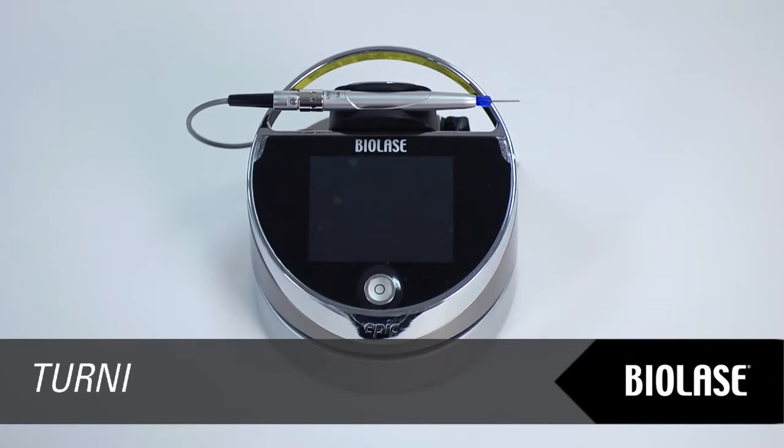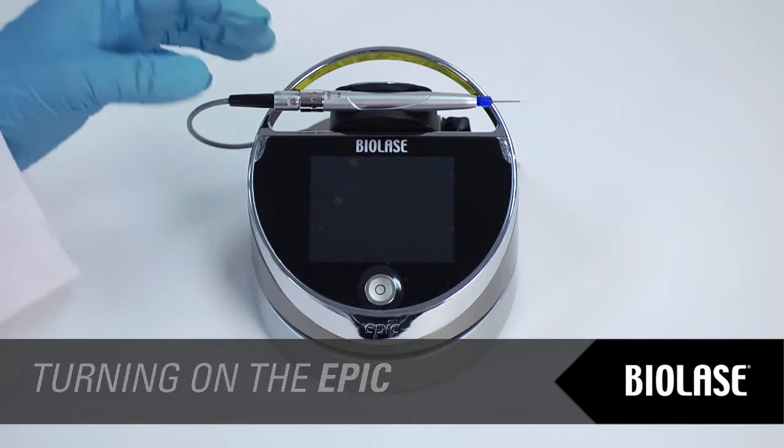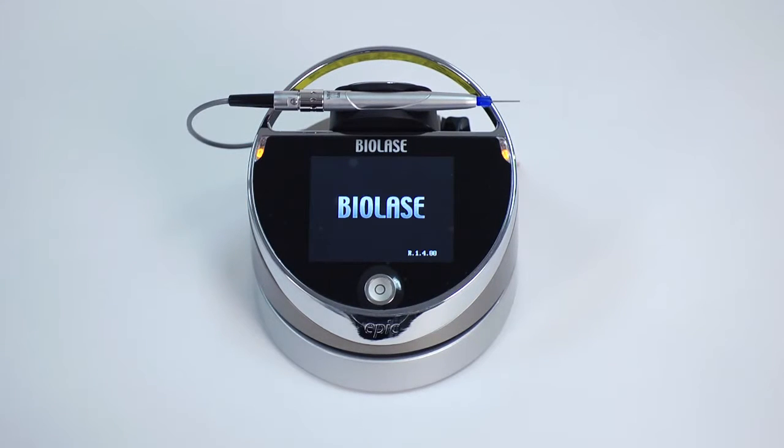Ensure that the battery pack has enough charge for operation, or connect the power supply cord to the power connector on the laser console. Turn the power switch at the rear of the base of the console to the on position. The Biolase logo screen will appear. After 3 seconds, the EPIC 10 welcome screen and keypad will appear.